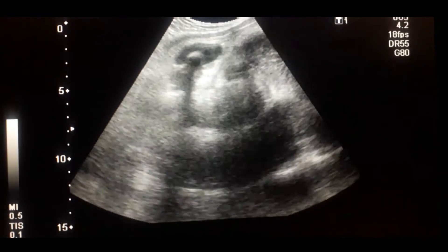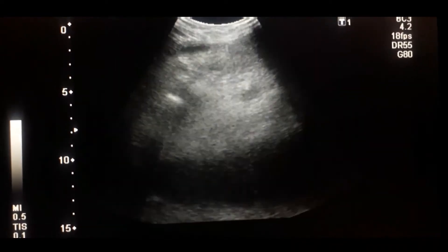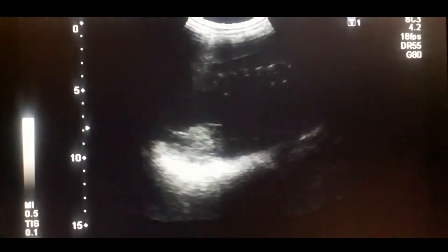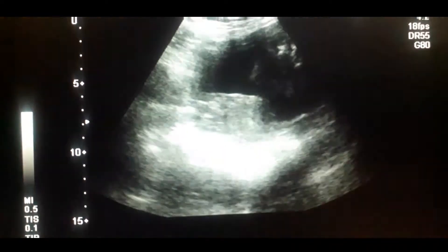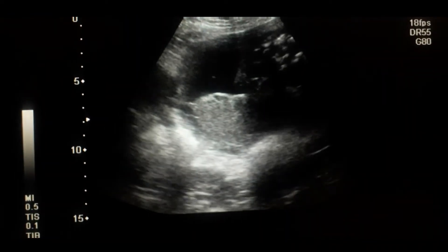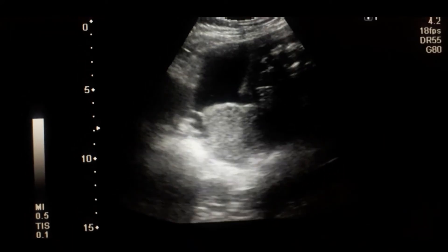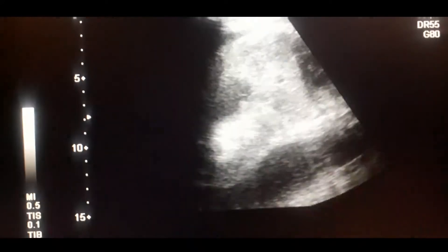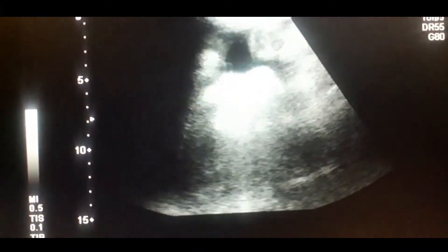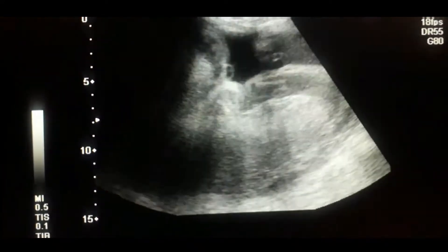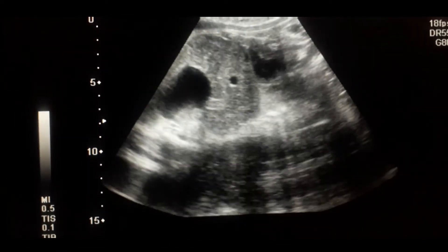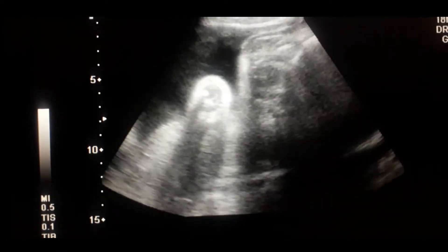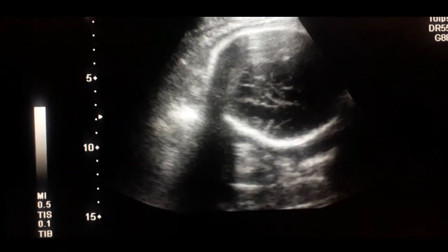Looking at the other parameters of the baby: fetal heart is okay, fetal movements are okay. You can also see the grade 3 maturity placenta, which is posterior and fundal. The cardiac activity is okay.